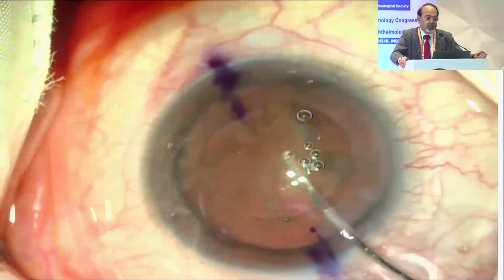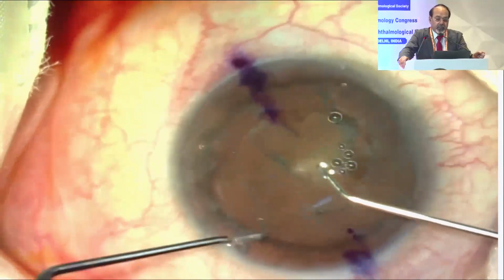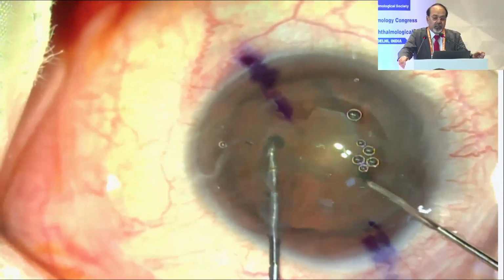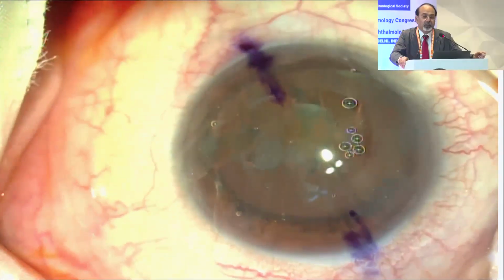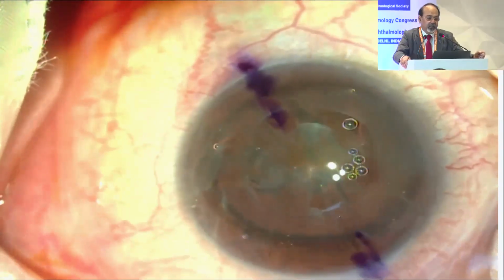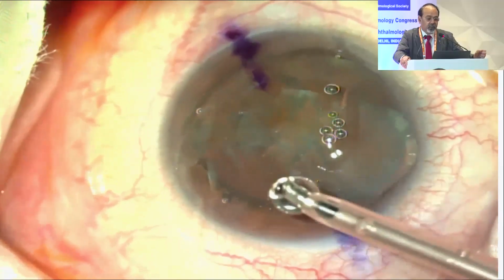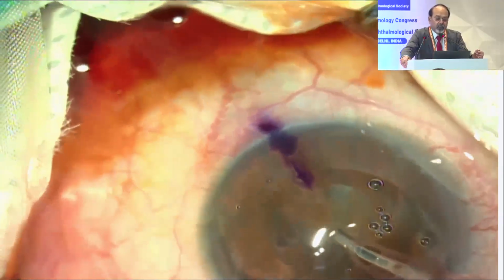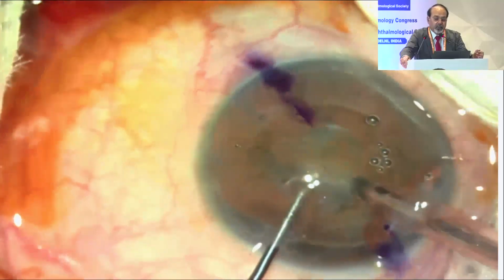And you can see that there is a very nice capsulotomy done by the laser, and the incisions, the cuts which are there because of the laser, do not hamper the effect of the femtolaser in reaching the lens. So there is no defect in the capsulotomy, and there is no need to pull the capsulotomy out. It is already separated, as you can see.